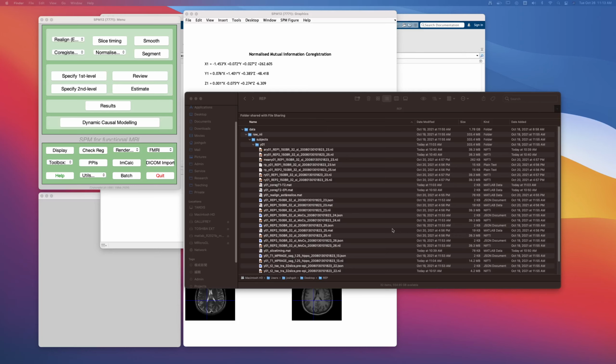But very often in fMRI studies, where we collect many subjects, a group of subjects, we will want to have a common template where we can say, in this coordinate XYZ location, everyone's hippocampus is in this location. We want to bring everyone's hippocampus or different brain structures to the same template so that we can make meaningful group level comparisons and make meaningful group level statements about that location, about that same brain structure.